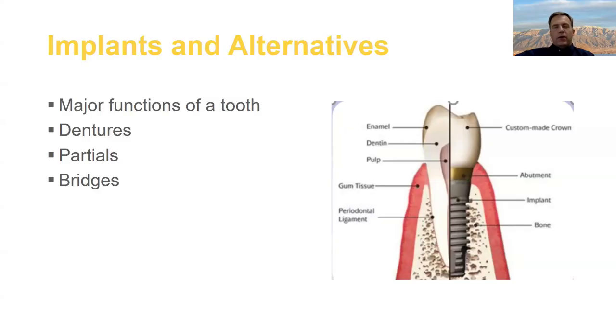As you hear out there in the implant community, implants are not teeth. Especially the shock-absorbing aspect of the periodontal ligaments is something that's obviously not present with implants and tends to put more load on our restoration. So it's better to have a natural tooth than an implant, but I would say the second best thing is a dental implant. Now, why am I telling us this obvious stuff?